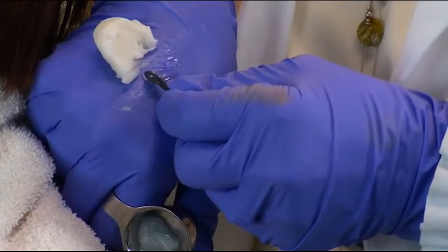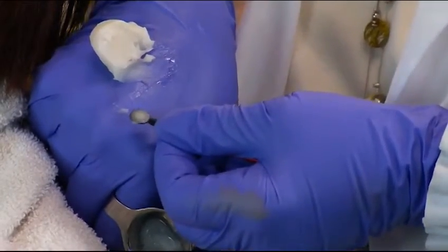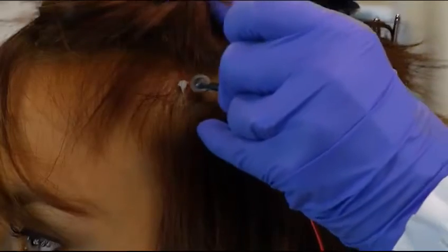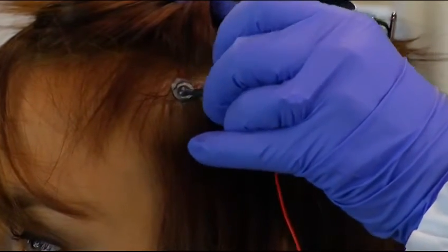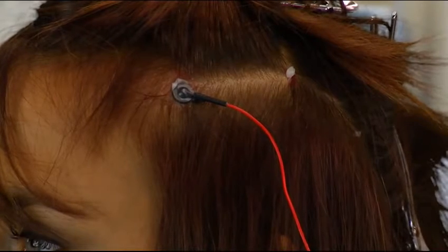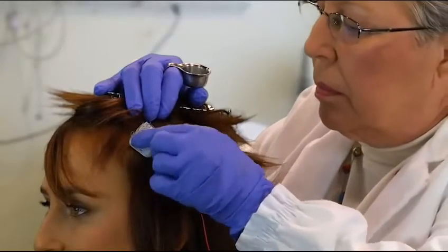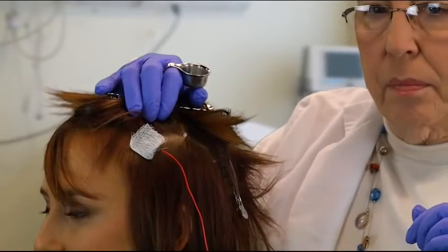You want to fill the cup just full with the 1020 paste. Don't overfill it — it should be flat on the bottom. Place the electrode on the spot and give it a little push. Don't worry if a little paste comes squirting out the hole in the top of the electrode; we'll use that to hold the electrode on. Put one of your gauze squares on top and give it a little tap. That's all there is to it.